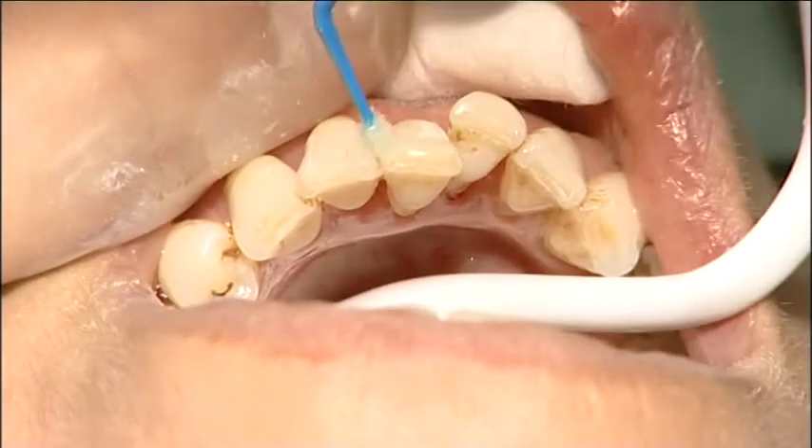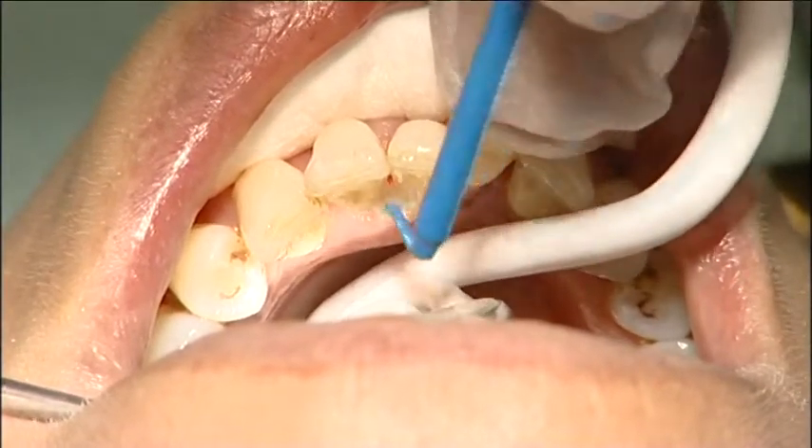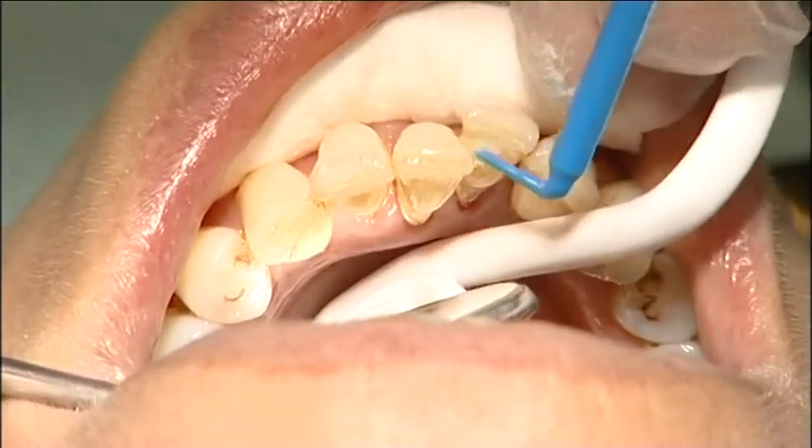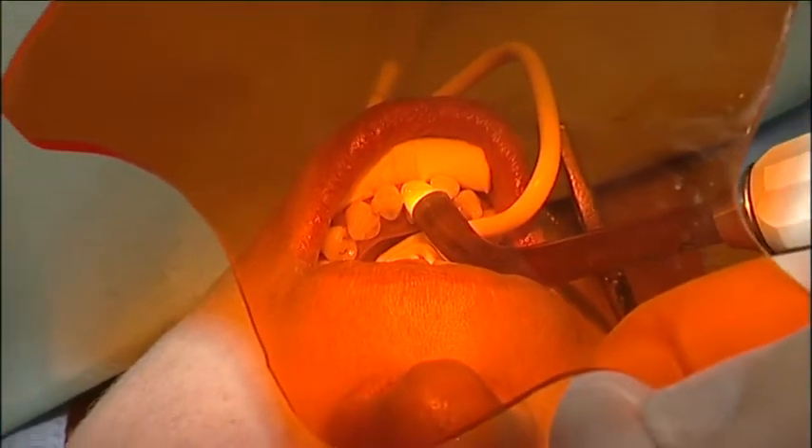The bonding agent was applied over the whole area of the etched enamel and light cured as the bonding manufacturer recommends.